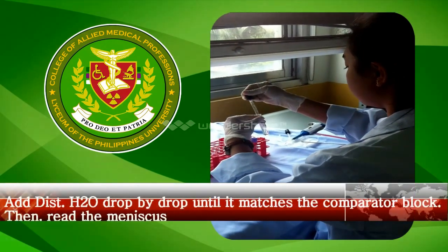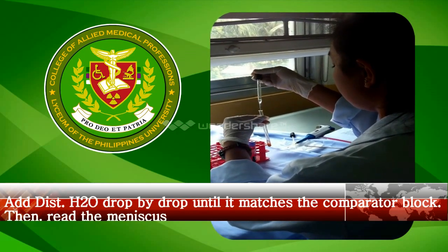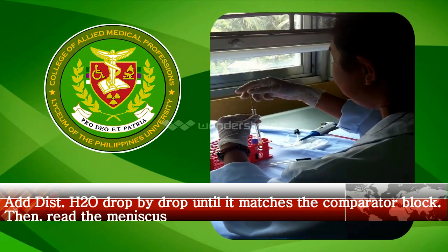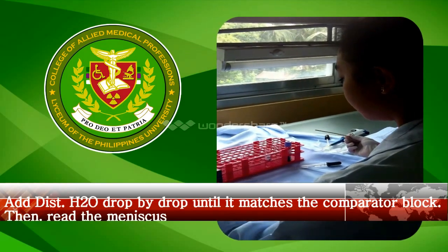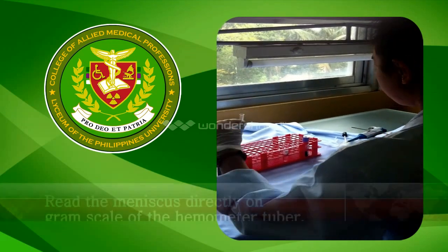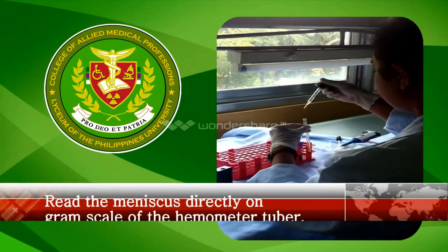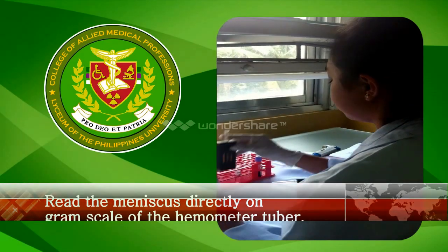Place the tube into the comparator block. Add distilled water, drop by drop, until the color of the diluted sample matches that of the hemoglobin standard in the comparator block. Read the meniscus directly on the gram scale of the hemometer tube.